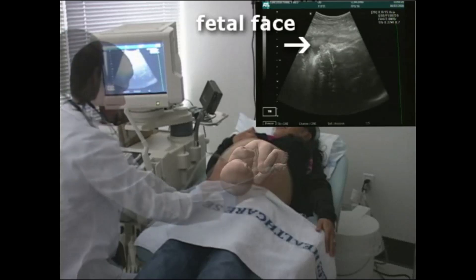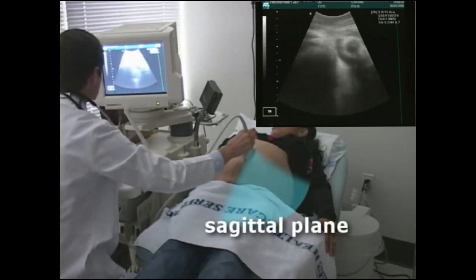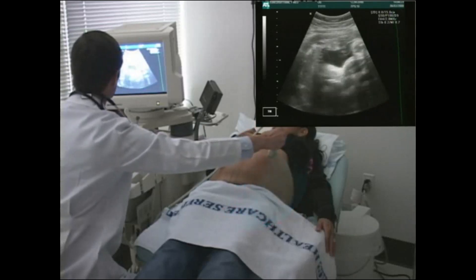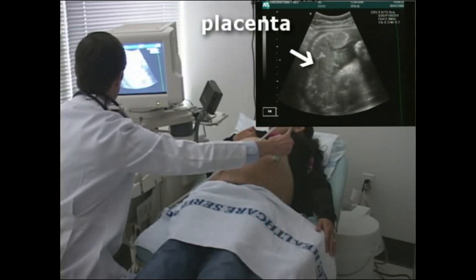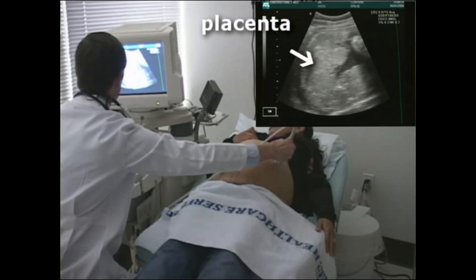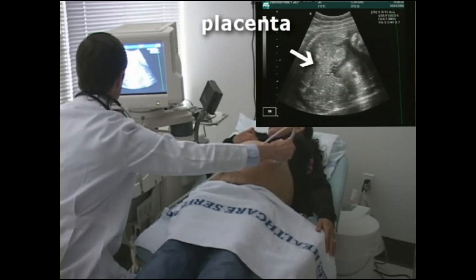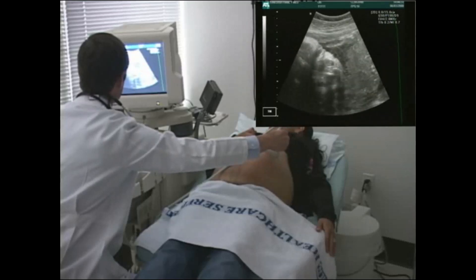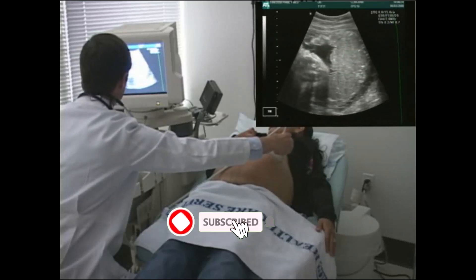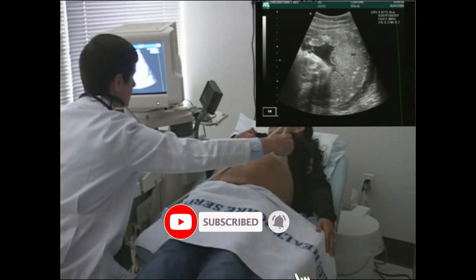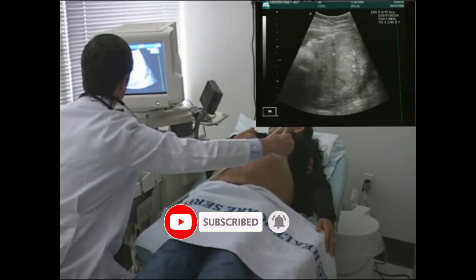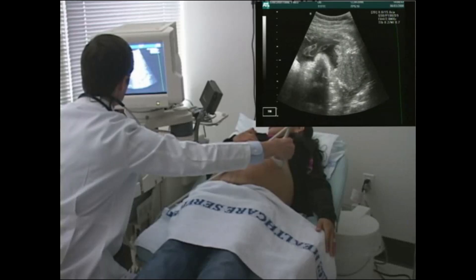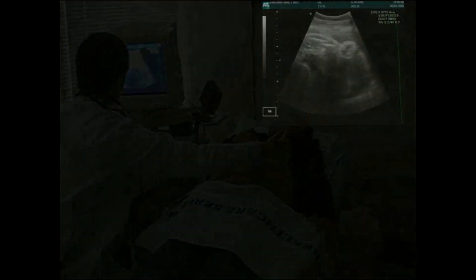Record all findings. Scan with the transducer in the sagittal position, slowly scanning from the lower uterine segment to the fundus. The placenta appears as hyperechoic tissue. Calcifications may be observed. If the placenta cannot be visualized, it may be located posteriorly, obscured by fetal parts. Note the position of the placenta. If the placenta is near the cervix, or placenta previa, this should be noted as well. Record all findings.